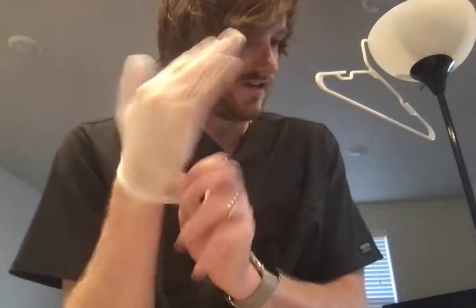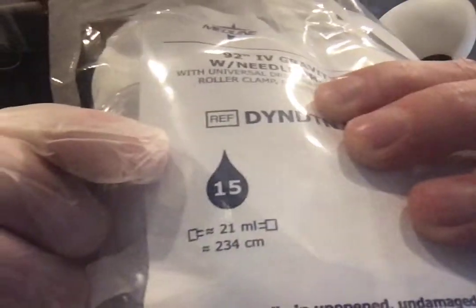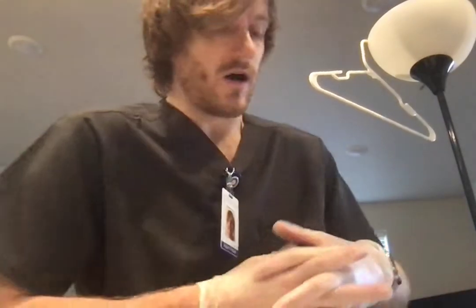The GTT is the drop rate, the drip factor, and that's going to be on the packaging for most IV kits. Typically 15 is the default, but you might have something like micro drip that has a different drop rate. So if you're calculating without a smart pump, it's always important to know what your drip rate is, depending on the tubing.